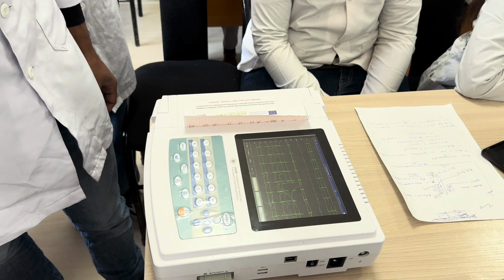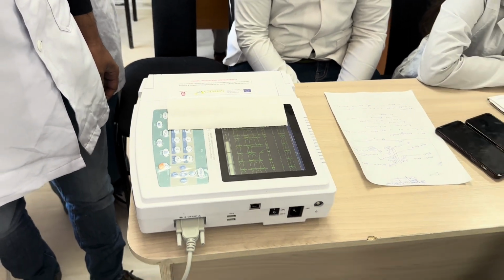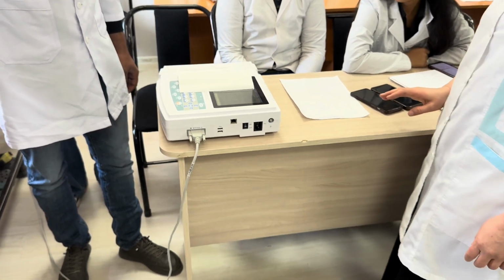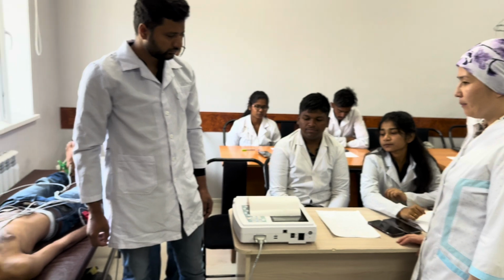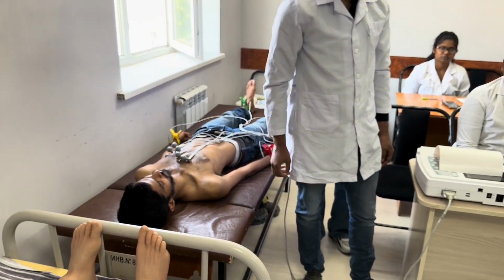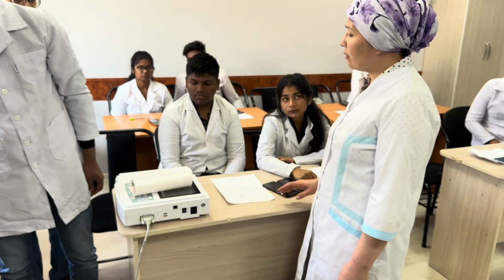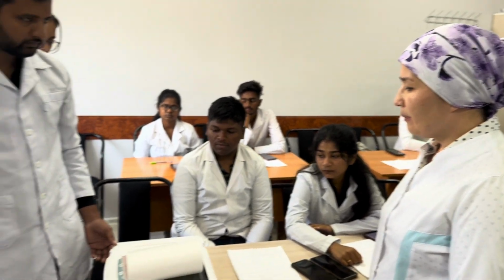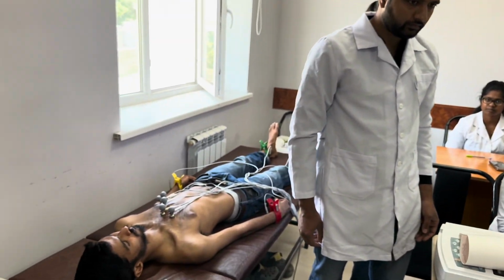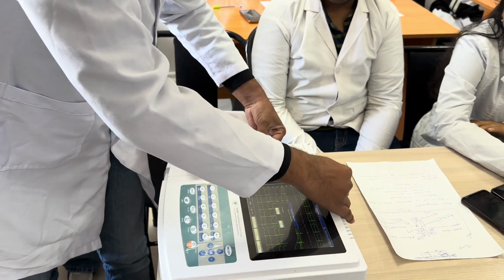The patient this time is not moving, not talking, and we remain very quiet and focused. After 4 heart cycles, it stops. Okay, take a photo. Yes, cut.